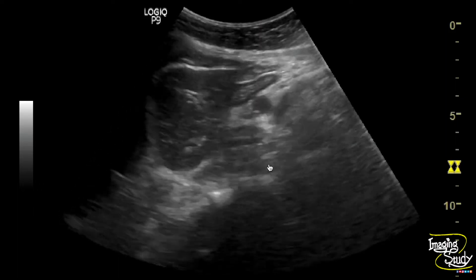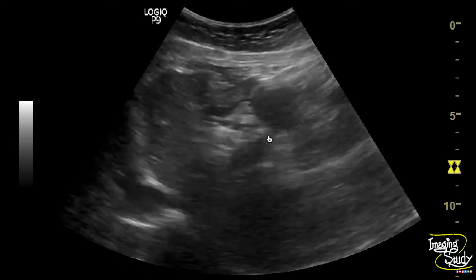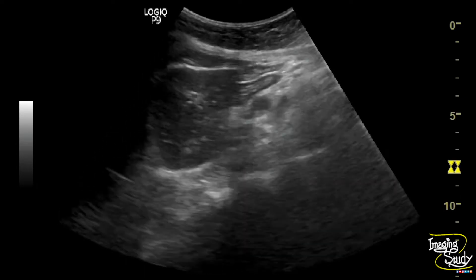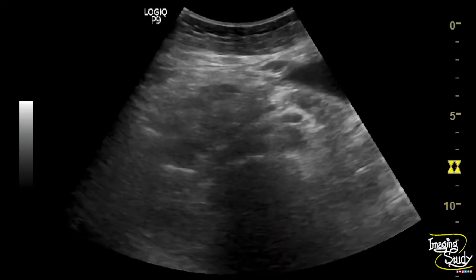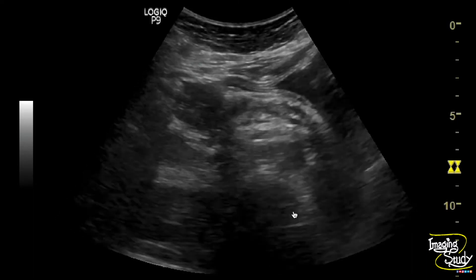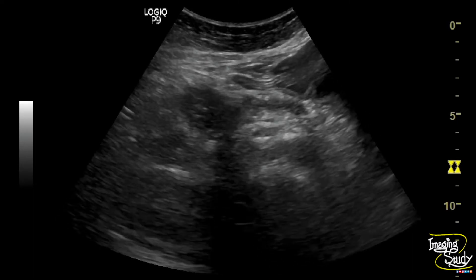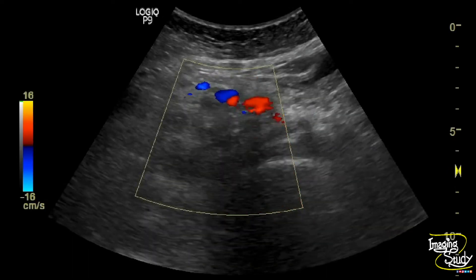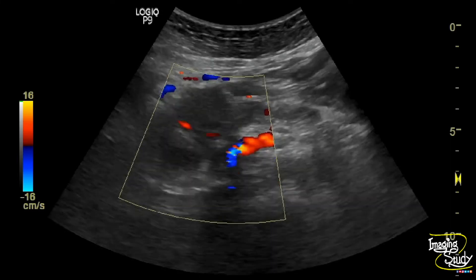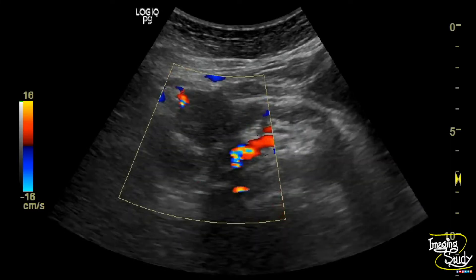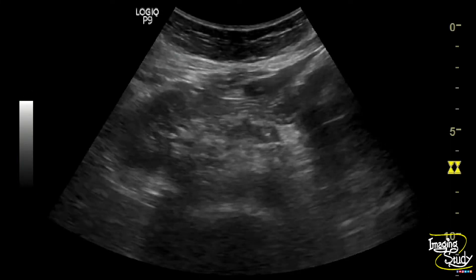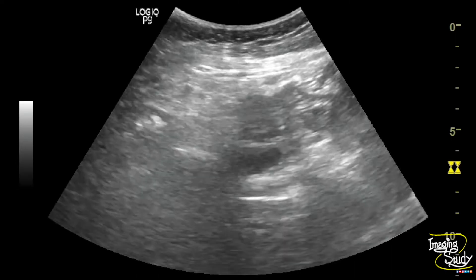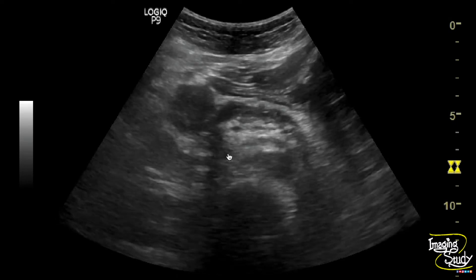Here you can see the longitudinal section and this is the pancreatic head mass, which is surrounded by some blood vessels. This is the mass and its relation to the surrounding structures.